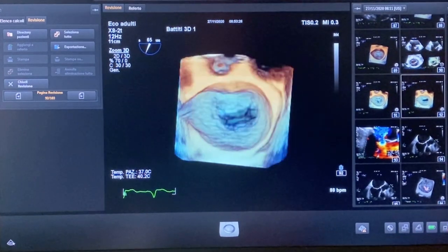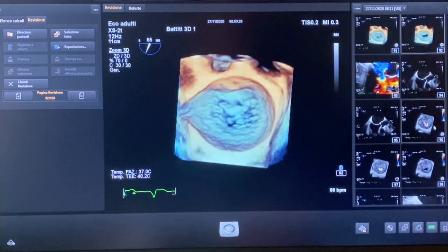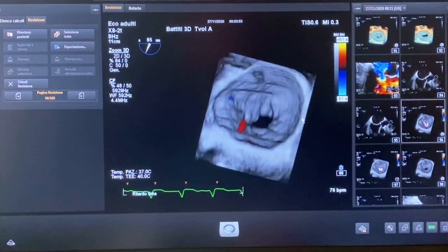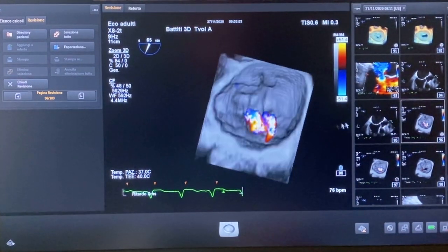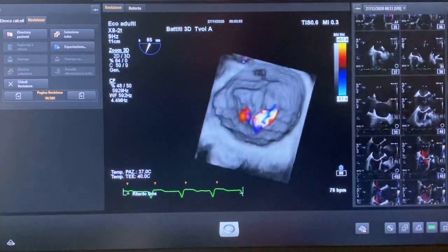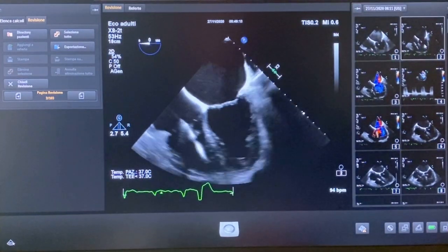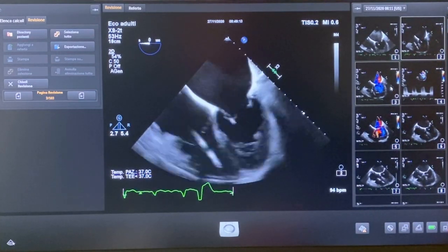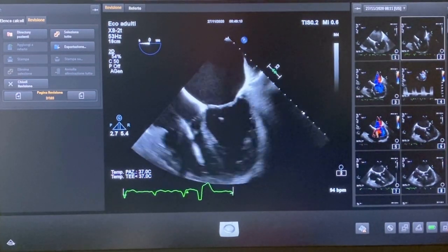Here we can see the mechanism of the mitral regurgitation, and we can also put the 3D color on. In this case we can see the regurgitation which is central and a little bit medial. This is indeed a case of functional mitral regurgitation due to annular dilation and tethering of both leaflets, related to left ventricular systolic dysfunction and papillary muscle displacement.